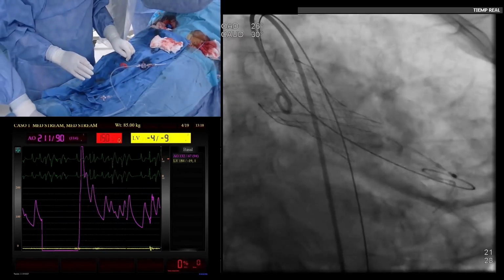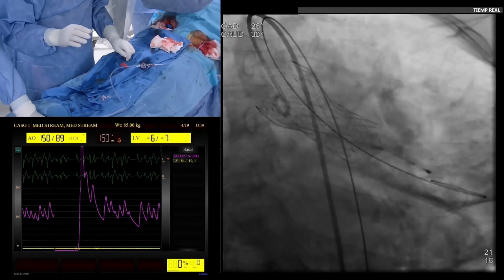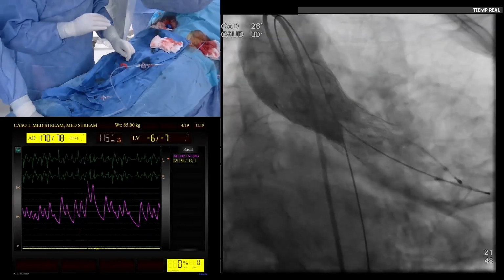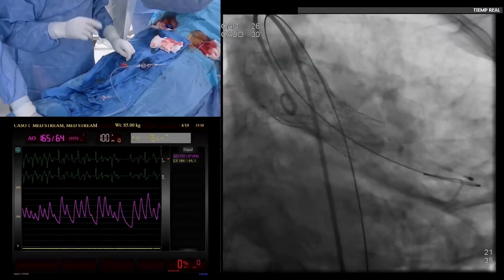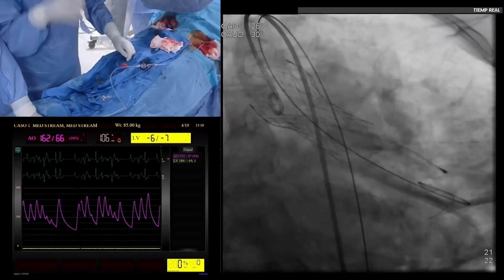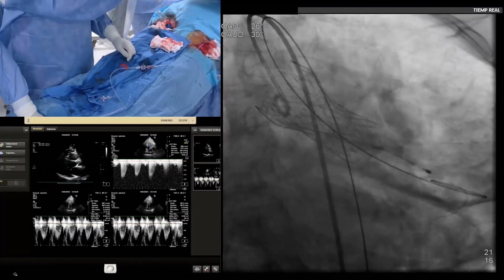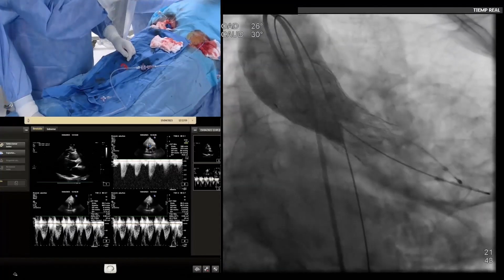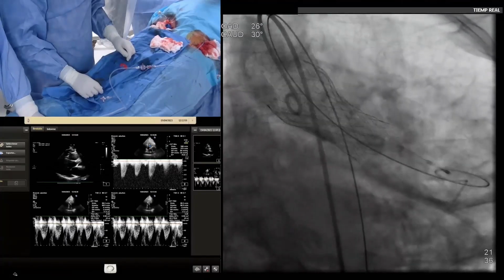I think the outcome is beautiful. As you can observe, almost both sinus are completely collapsed. So probably the depth of the valve is not that deep as is seen here in the aortogram. Let's put in AP view and let's check by echo. I think if I were to go a little bit higher, I would have some problem with the left main.